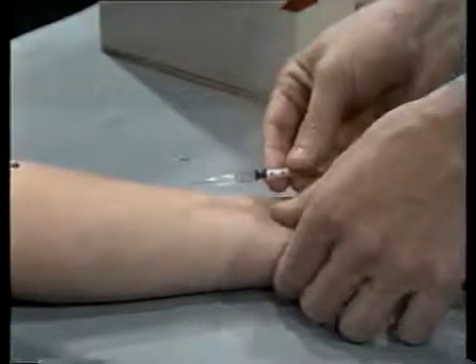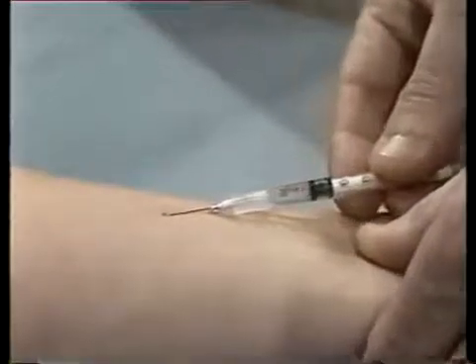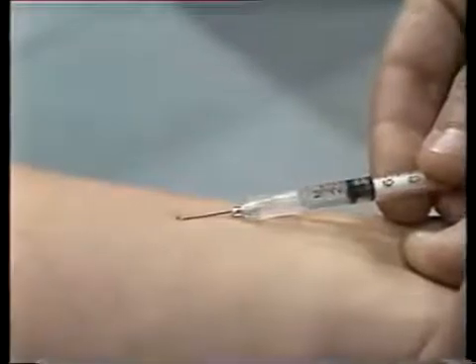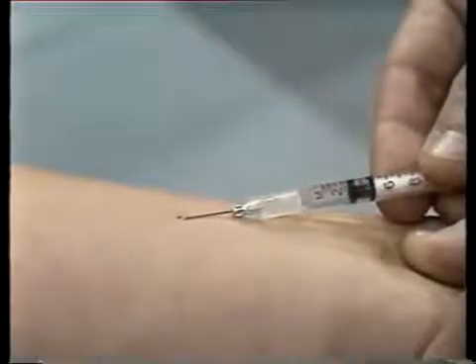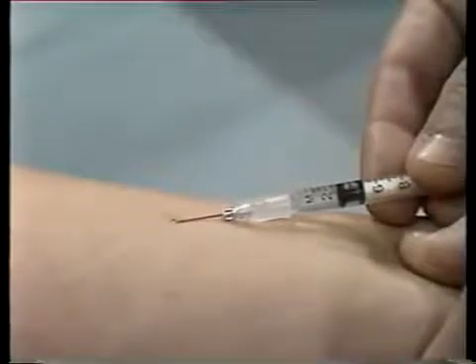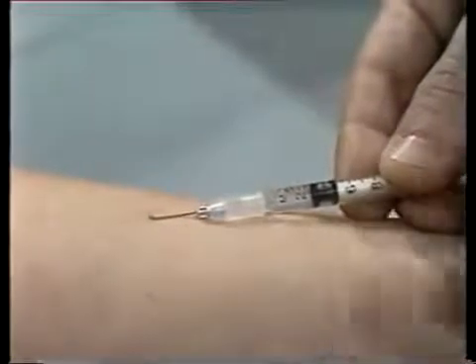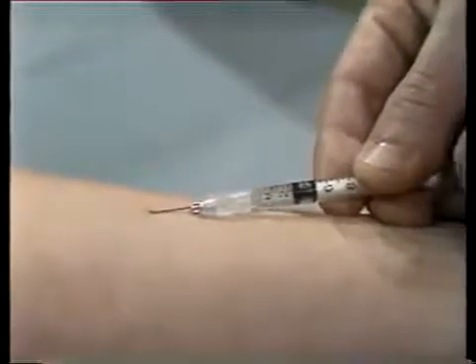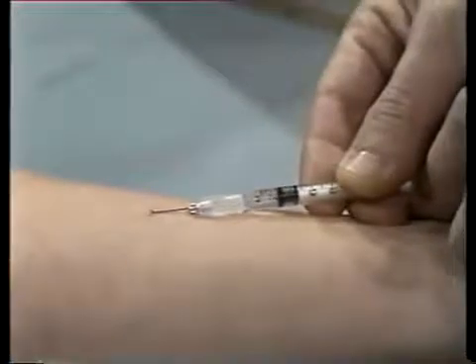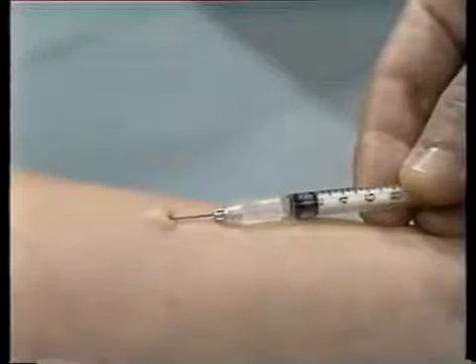Next, stretch the skin tight across the forearm at the injection site. Hold the syringe so that the needle is at a flat angle, almost parallel to the skin — about 15 degrees. Insert the needle only enough so that the cutting edge or bevel penetrates the skin. When the needle has penetrated, use your other hand to operate the plunger and inject a small amount of solution. If you have inserted the needle correctly, a small, white, circular bump will appear on the skin.